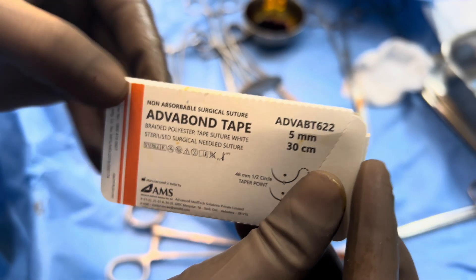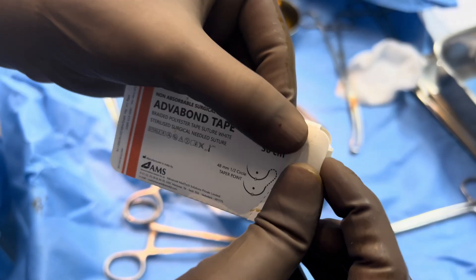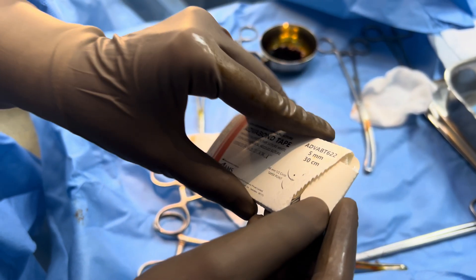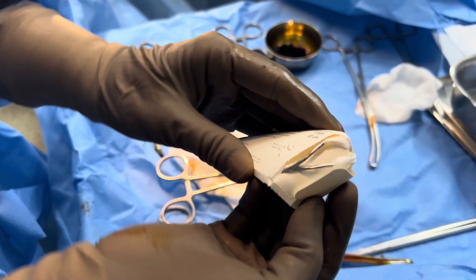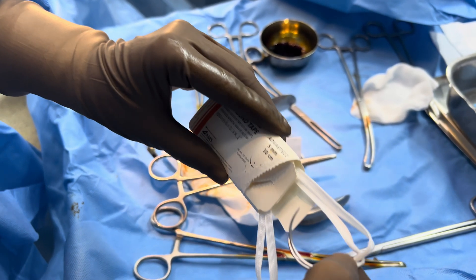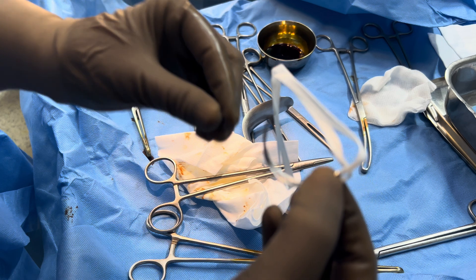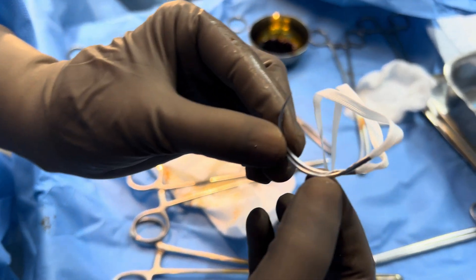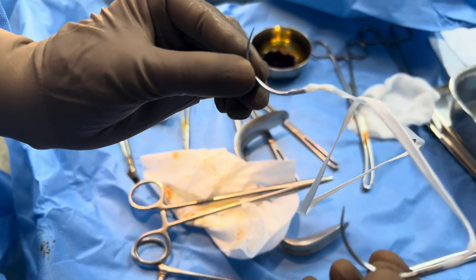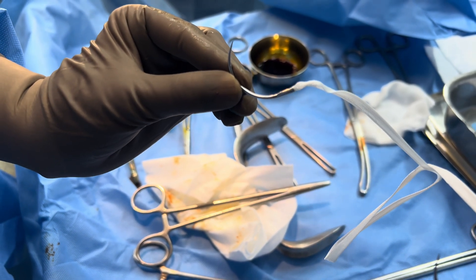That means it helps in penetration of the tissues easily with less trauma. This is white in color. It is coated with silicone, which helps in lubrication, and there is no need to apply xylocaine jelly for this needle. I have used this today for the cervical stitch procedure, and this is a non-absorbable suture.